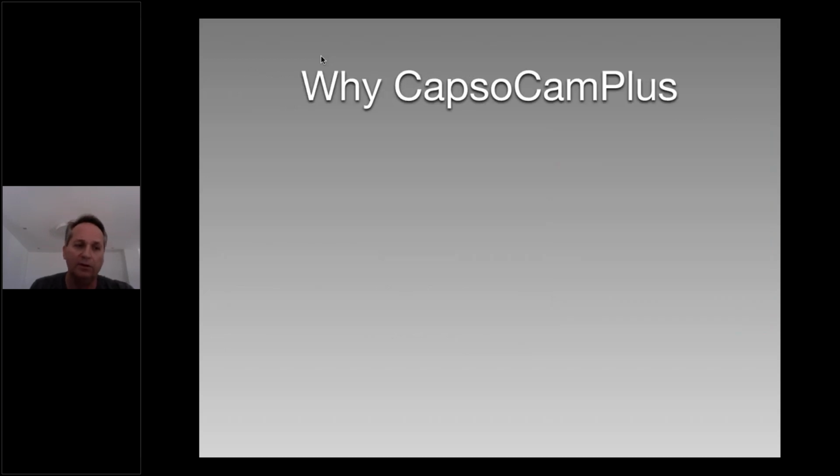So why do I use a lot of CapsoCam Plus? It's because of the 360-degree field of view.